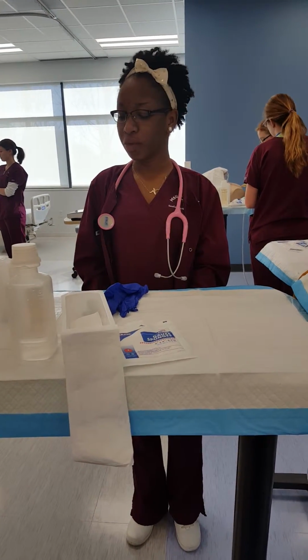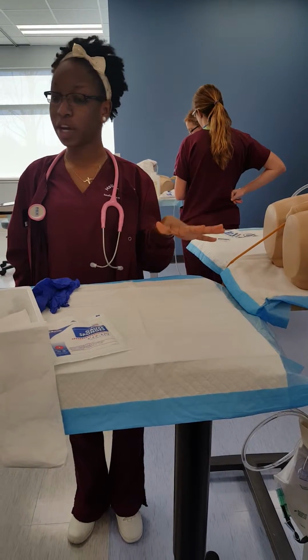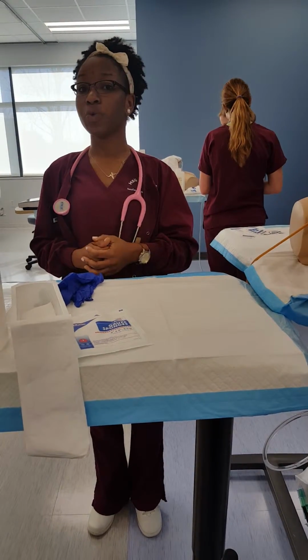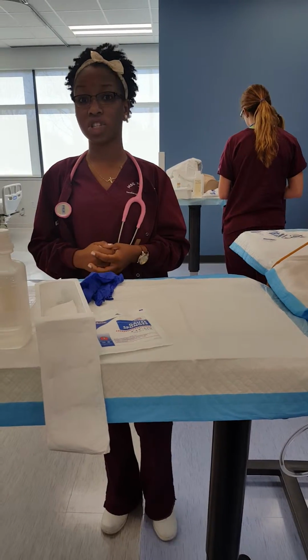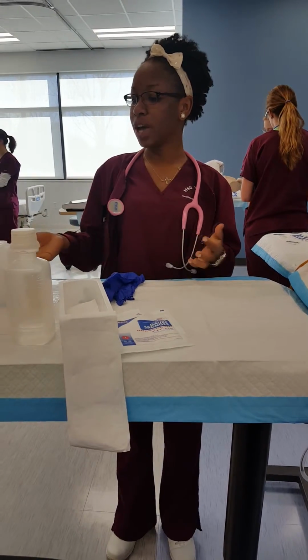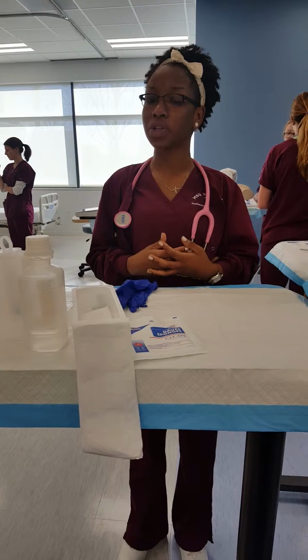Today I will be irrigating my patient who has urinary retention. I'll be irrigating him with normal saline, which is compatible with his medication, gentamicin, which I'll be instilling. Gentamicin is an antibiotic for the UTI he might be having. I'll be administering 10 milliliters of this and keeping it still for 2 hours.